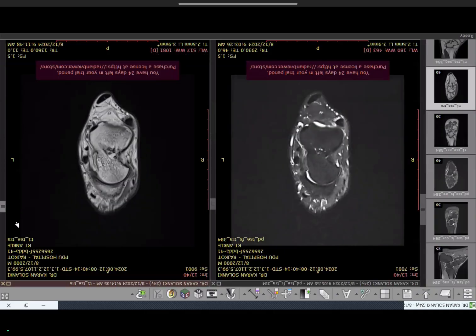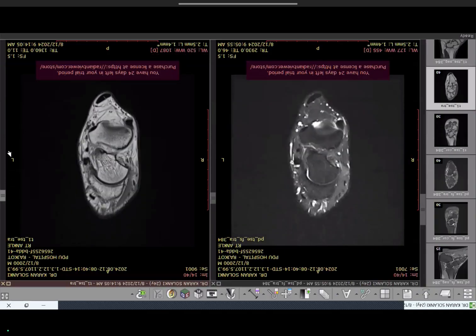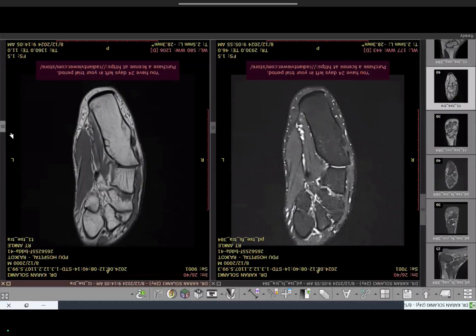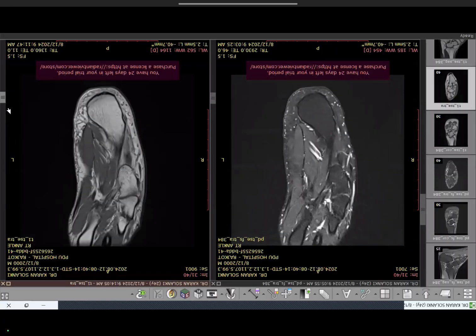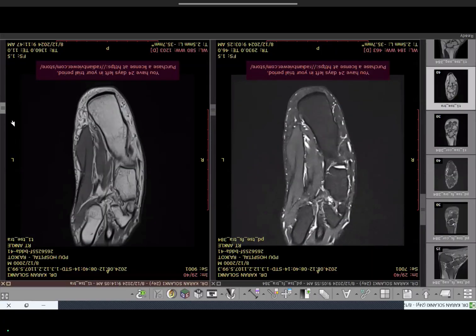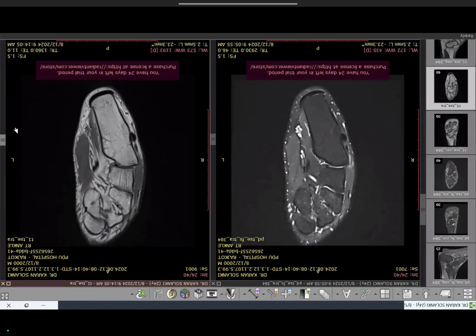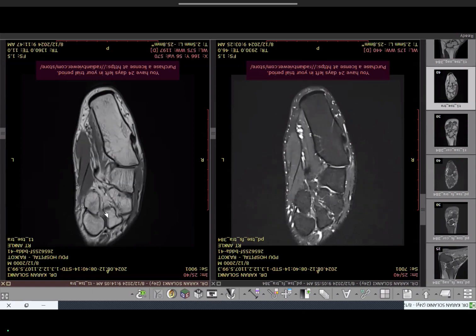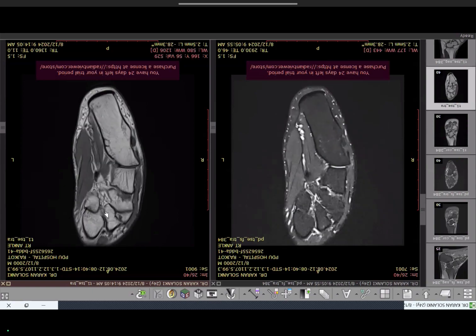Also identify the Lisfranc ligament here — attaching the medial cuneiform bone to the base of the second metatarsal. This is the dorsal Lisfranc ligament.